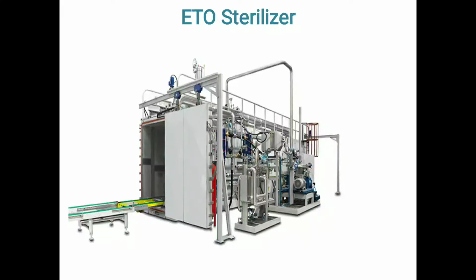This process involves evacuating the chamber and giving it a number of air washes to remove any trace of ethylene oxide gas, and then aeration. Finally, any residue of ethylene oxide in the product or material is removed through aeration, which can either be done in the chamber or in a specially designed aeration chamber. Okay, so likewise the process of ethylene oxide sterilization is carried out.